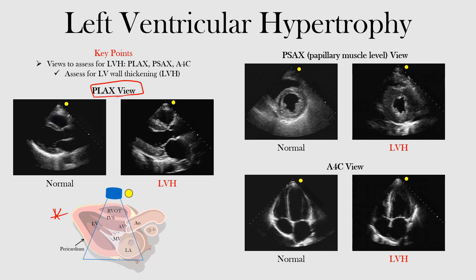In our parasternal long axis view, what we have most anteriorly is the right ventricular outflow tract. Our LV, our left ventricle, is here. What we're looking for in left ventricular hypertrophy is hypertrophy of the ventricular walls. Notice that we have our walls here — this is normal, and this one is going to show left ventricular hypertrophy. Notice the LV here and the wall surrounding it.